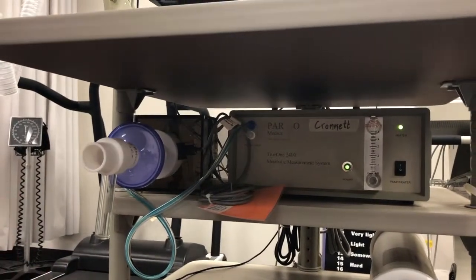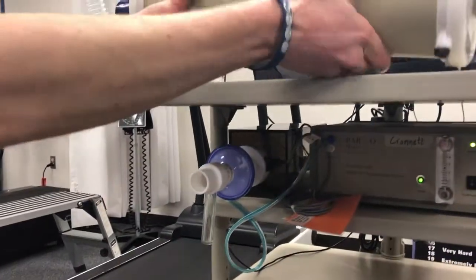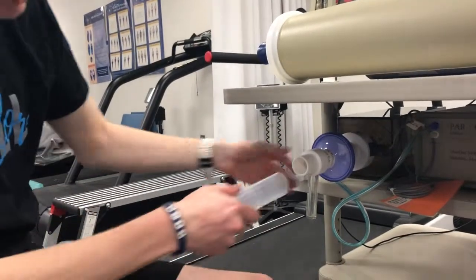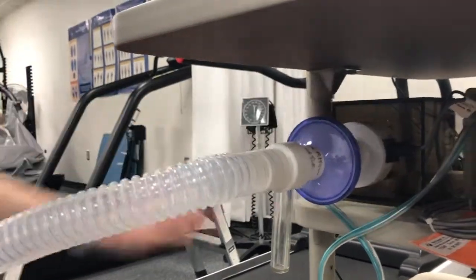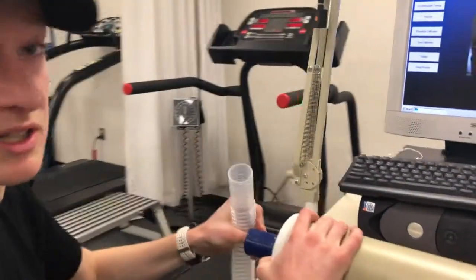Next we've got to calibrate the machine. To do that you're going to get the 3 liter calibration syringe and the tube. The tube gets plugged in right here to the mixing chamber, and then the other end of the tube gets plugged into the syringe.